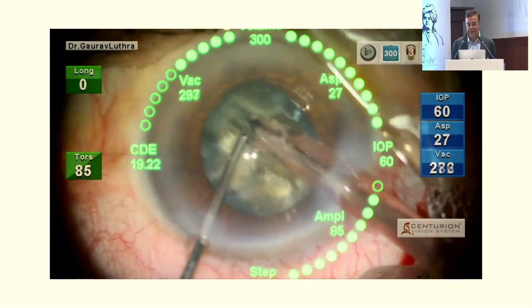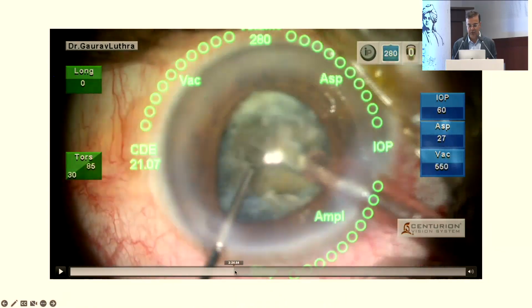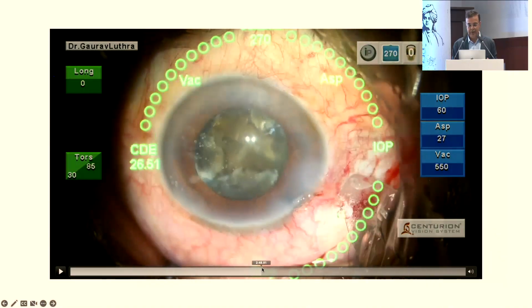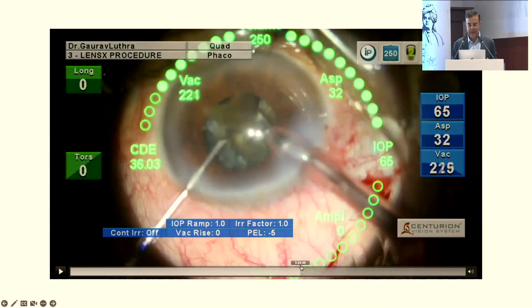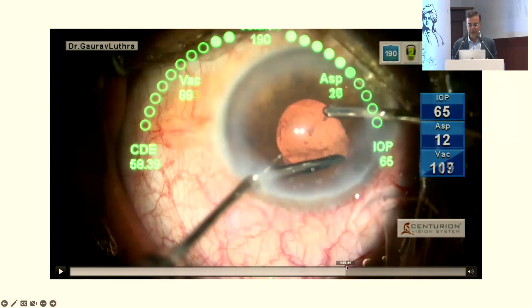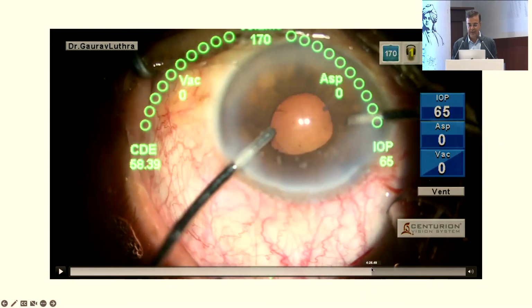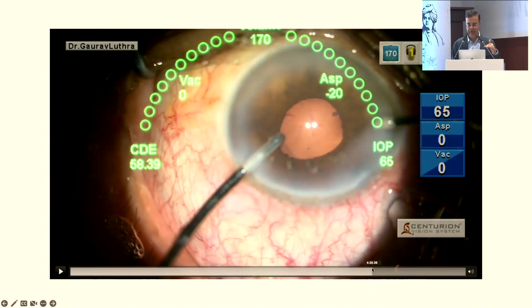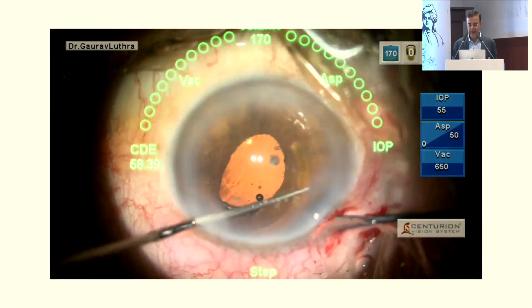So I realized that there was a rhexis break, and then I went to slow motion phaco, very gradual, with small pieces, getting each one out. It's laborious. The pupil starts coming down, but eventually you will get it. And as long as the flap motility sign is with you, which means that the flap is motile and moving freely and pointing upwards and out, you're lucky and you'll be fine.